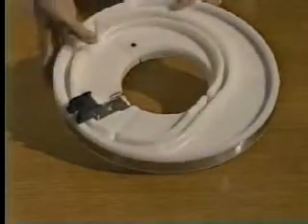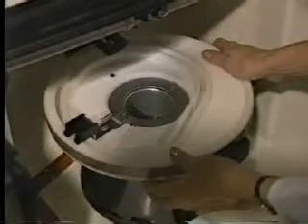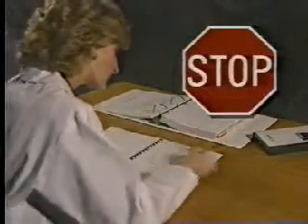To install the dual-stage filler, begin by rotating the centrifuge so that the centrifuge alignment dot and pin are facing away from you. Position the dual-stage filler so that the dots on the centrifuge and filler are aligned. Place the filler over the centrifuge assembly and press down until the filler locking pin is securely in place. Lower the filler latch. Lift up on the filler to ensure that it is securely in place and close the centrifuge door and cover. Stop the tape now and complete exercise 2 in your workbook.